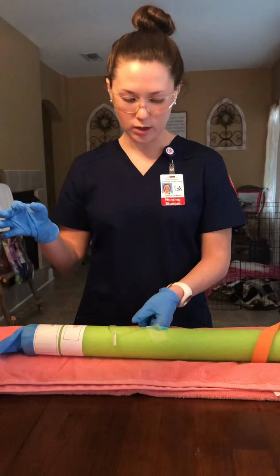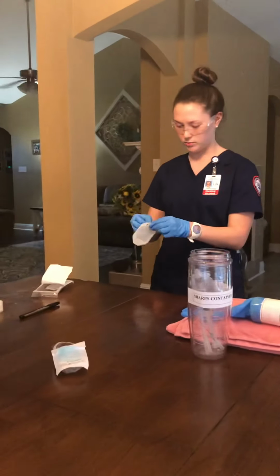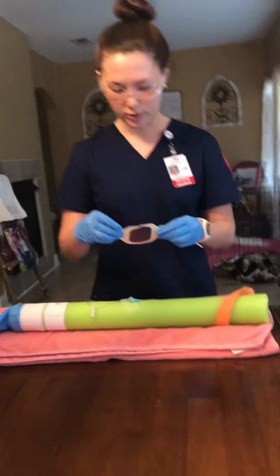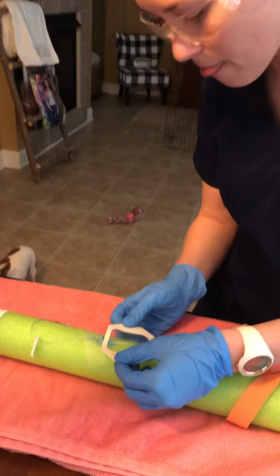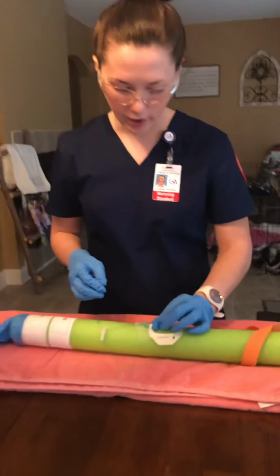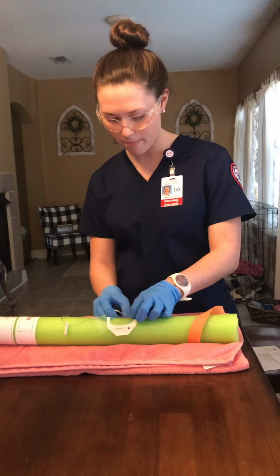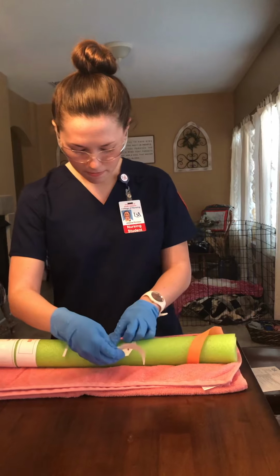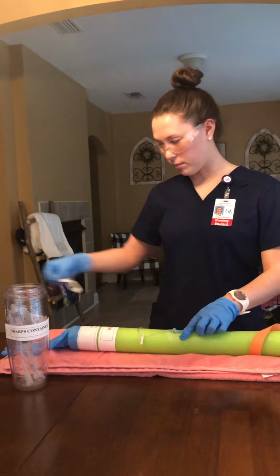So the next thing I want to do is apply the sterile dressing, or the transparent dressing. So I'm going to open this up. I'm going to avoid touching it underneath. So I'm going to put this on all the way up to the hub. So then once that is on there, I'm going to want to remove the trimming. Okay, I'm going to keep this for labeling.